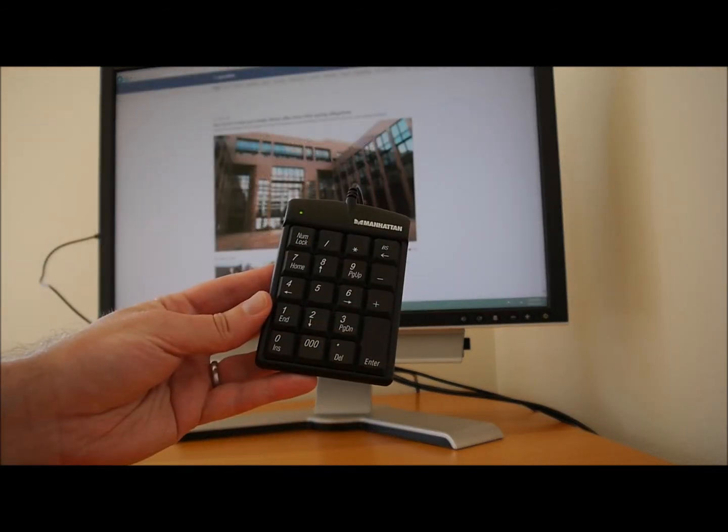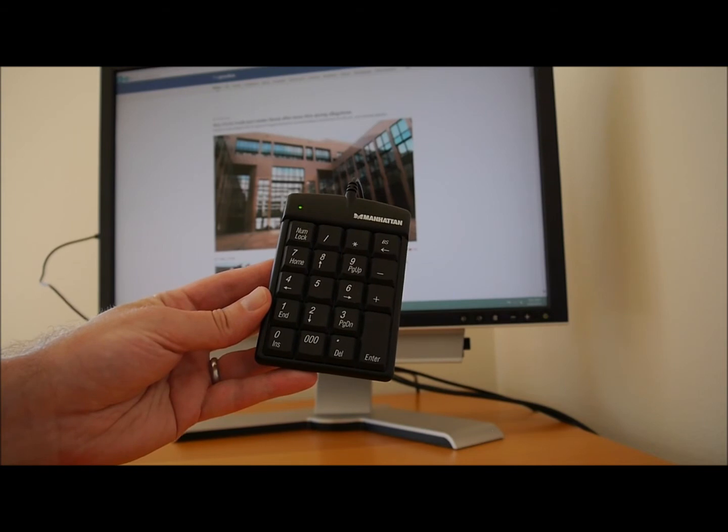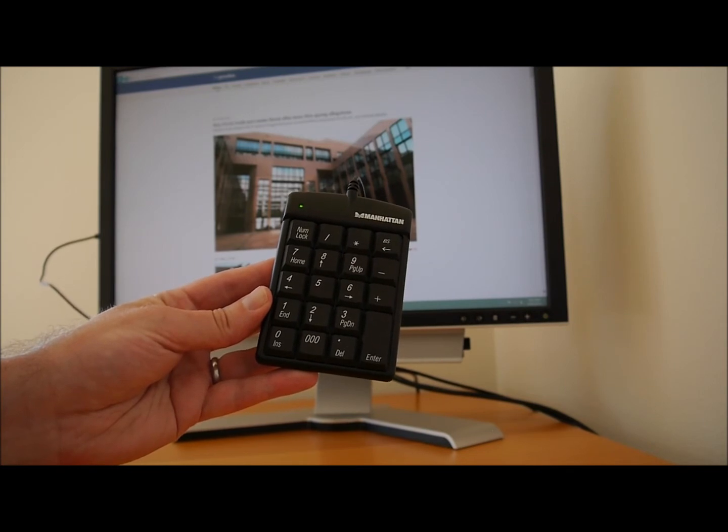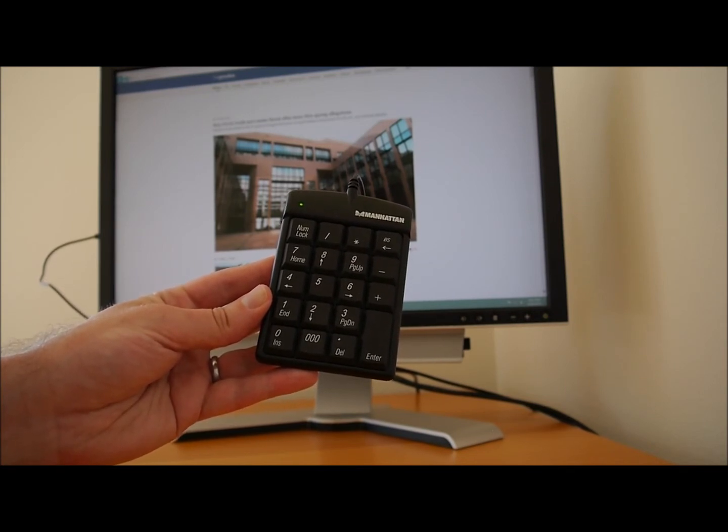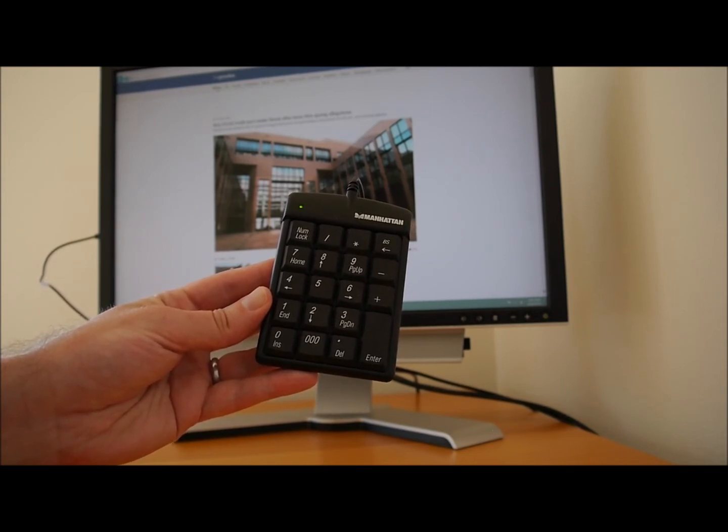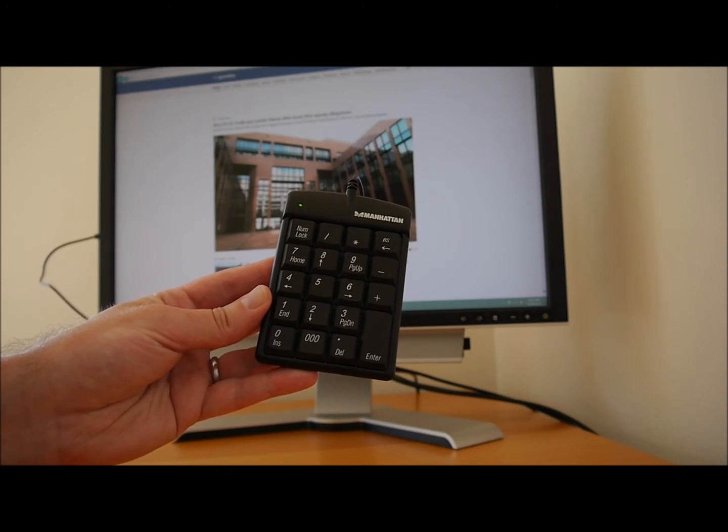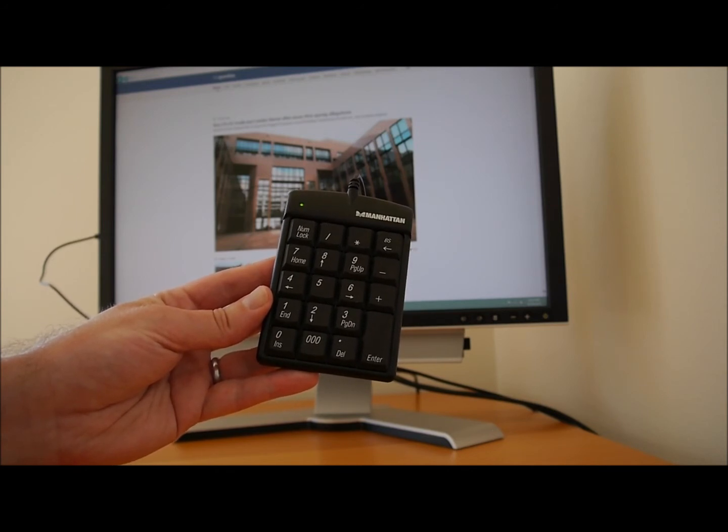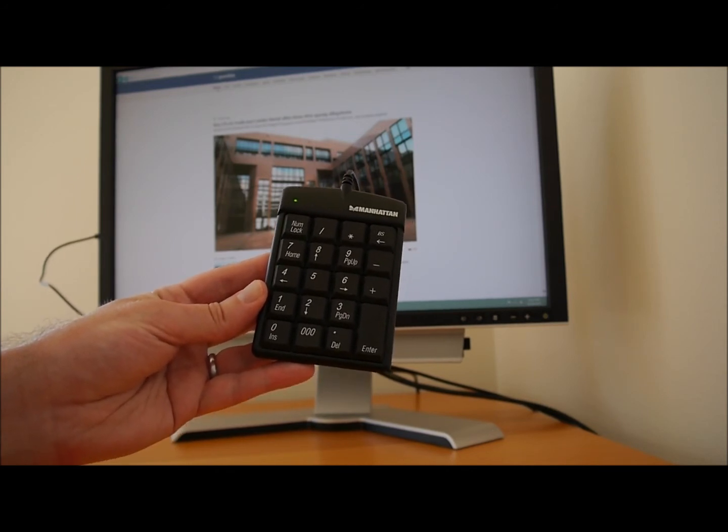So, there we have, with those 10 keys, a way to move through the pages on the Internet Explorer web browser and go to my favourites, with very little hand movement indeed. Now, depending on your situation, it might not be practical to have a full-size keyboard in front of you. So, a small plug-in number pad keyboard will work just as well with this program.